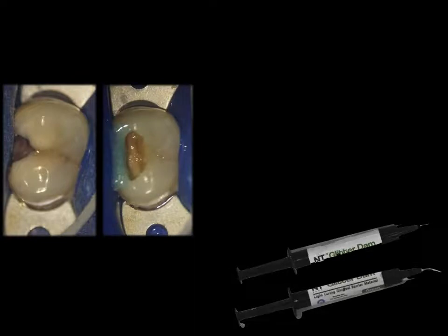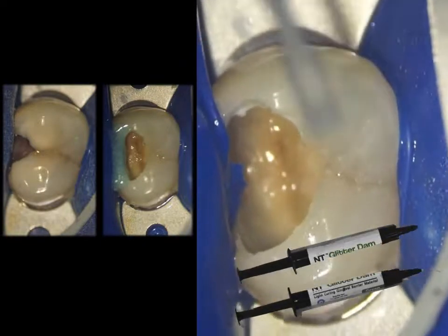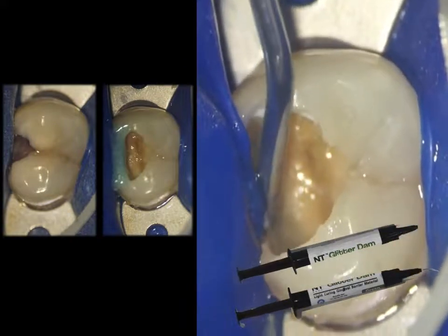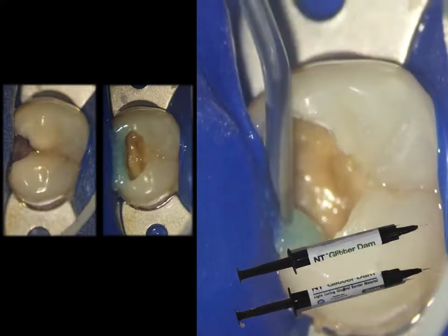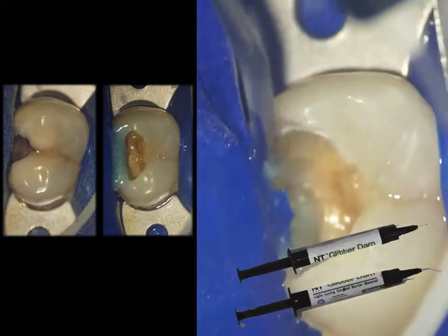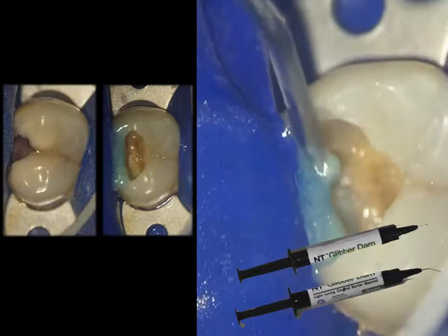Once the work is done, we can just remove this and replace it with a temporary filling. Sharing another similar situation where we isolated the tooth first and then created a resin barrier for access refinement and root canal treatment. The contacts had not been cleared, and while putting the rubber dam inside you can notice there is a little tear as well — such things are quite common under magnification. The canals were not exposed, so we just sealed the side wall with the help of the NT Glitter Dam.